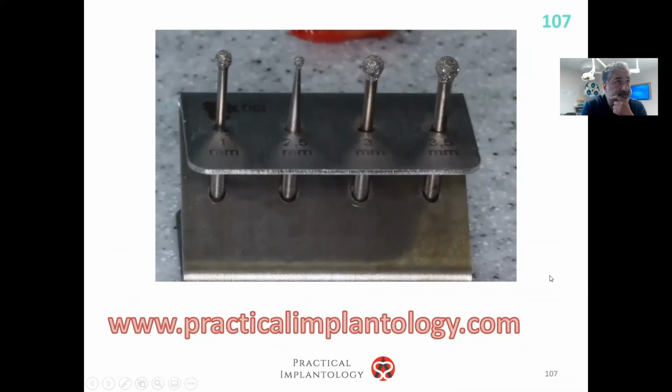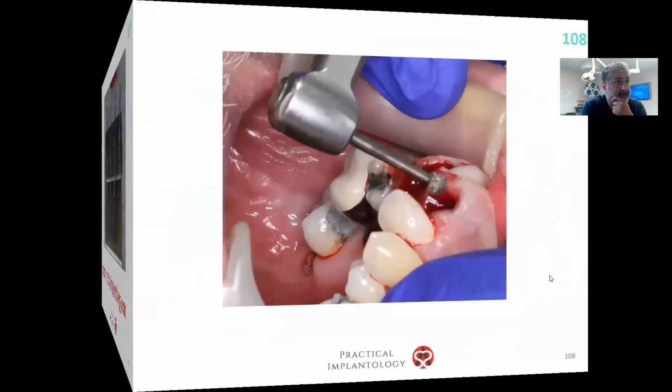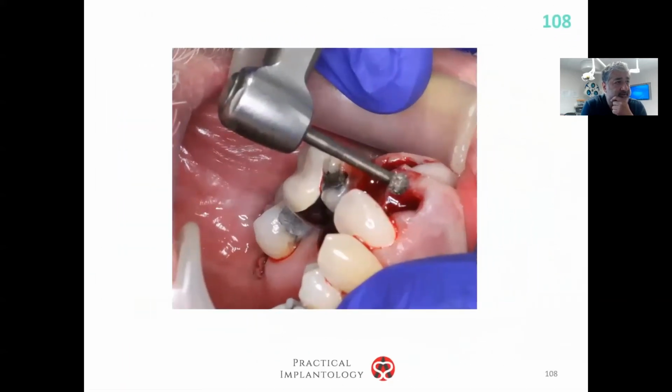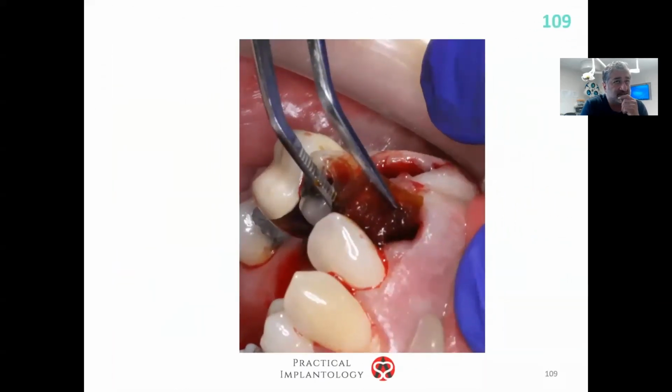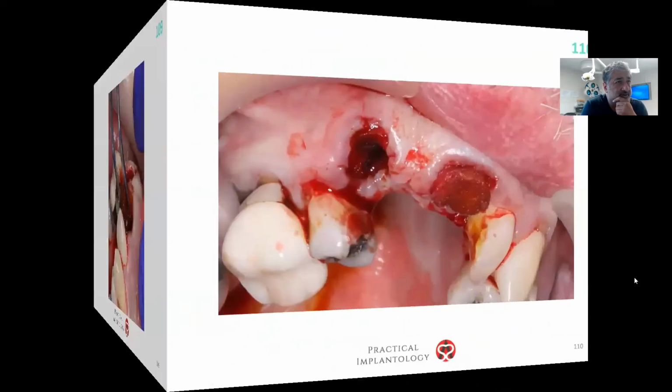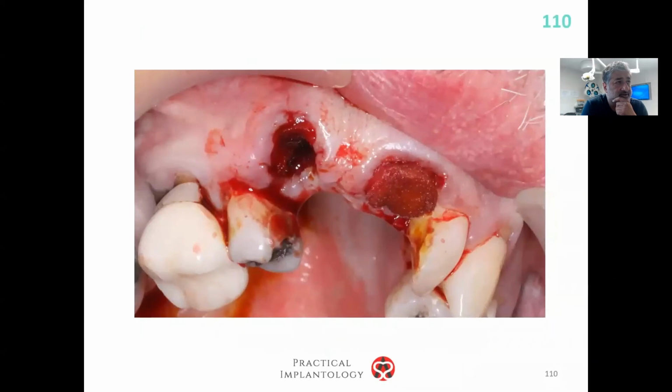We've got degranulation burrs. So in this case, there was minimal soft tissue, so I didn't need to use straight to curettage. I went straight to the degranulation burrs. If there's a lot of soft tissue, don't go to the degranulation burrs straight away. You'll create a mess. I then, once it's degranulated and slight decortication, not on the buccal plate, decortication around the rest of the tooth, I then took the 50-50 betadine saline mix and I plugged it into the sockets, and I waited.